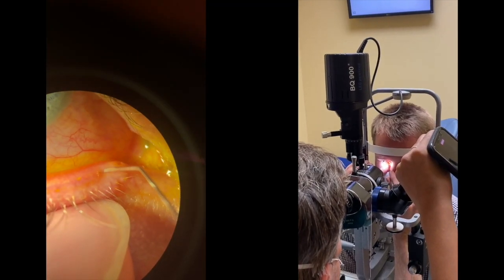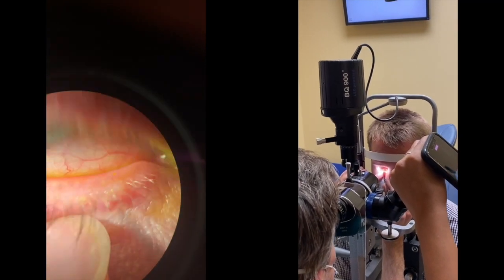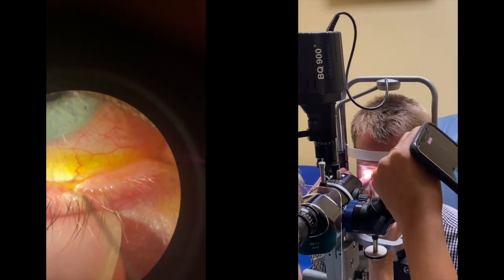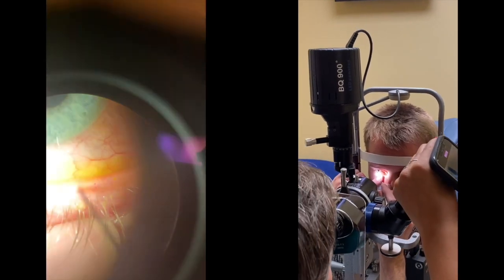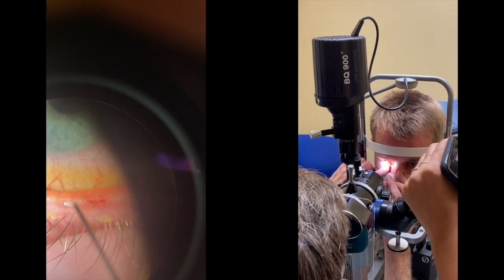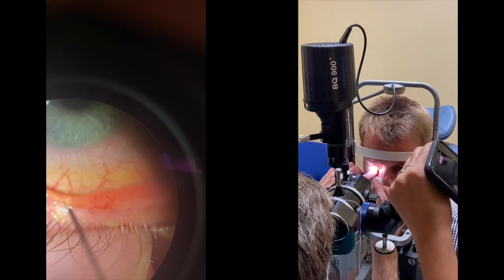If the 2mm probe does not work you can go down to a 1mm probe, and after the 2mm you move up to a 4mm probe. All of the lids can be probed in this fashion, however the lower lids tend to benefit most since they are the ones that tend to be most inspissated and are also easier to address.